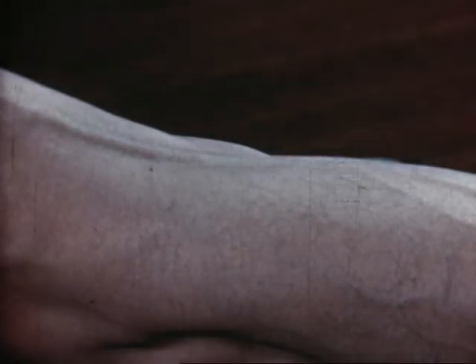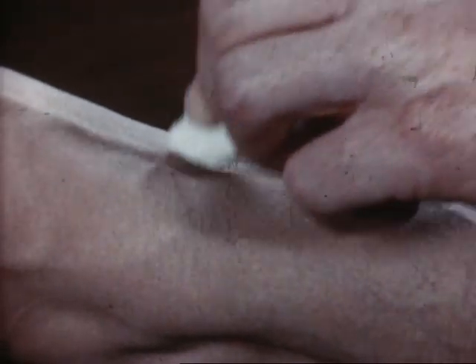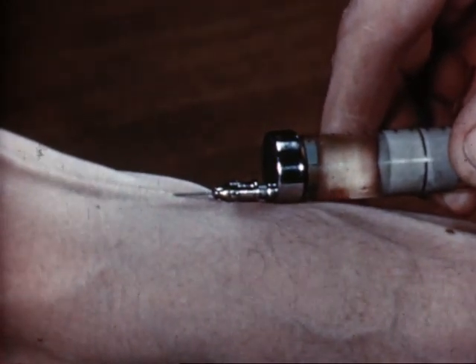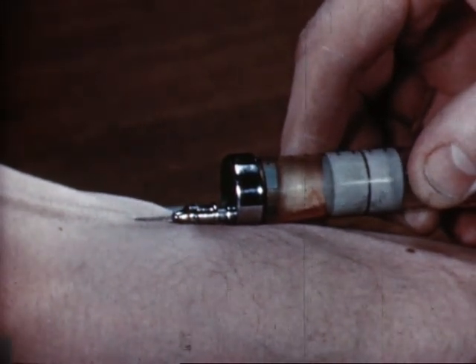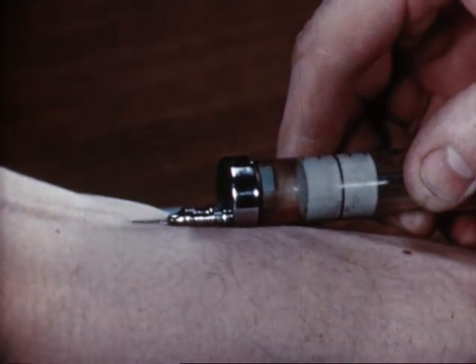Venipuncture is not done solely for the purpose of obtaining blood specimens — many drugs are administered by the intravenous route. Some are highly destructive to tissue if they get outside the vein. Therefore, be sure that the needle is in the vein by withdrawing a small amount of blood into the syringe, and release the tourniquet before the injection. An accurate technique is vital on such occasions.